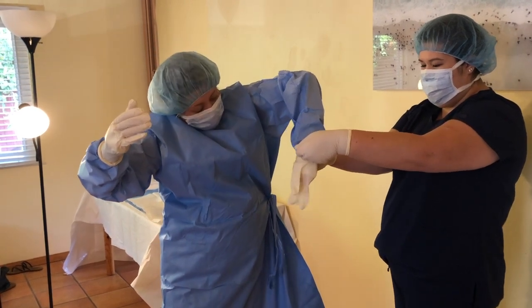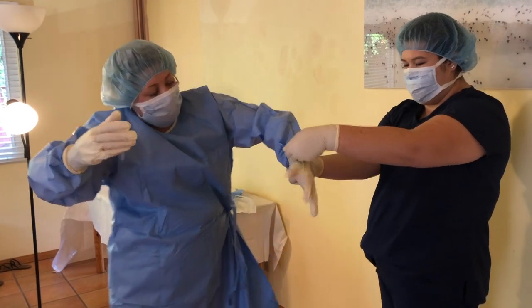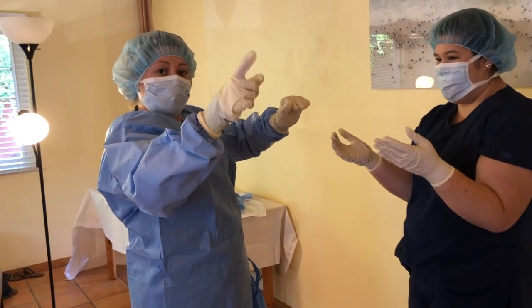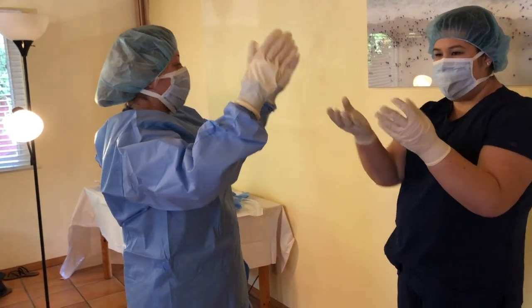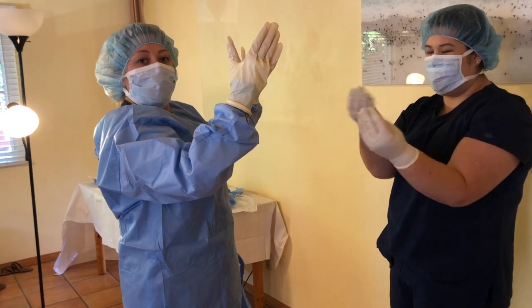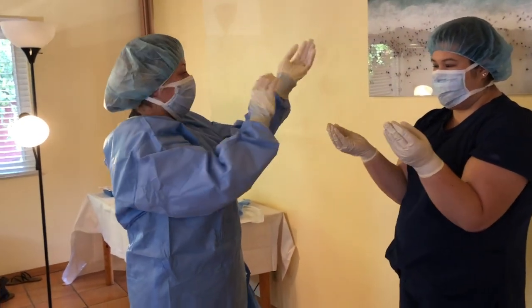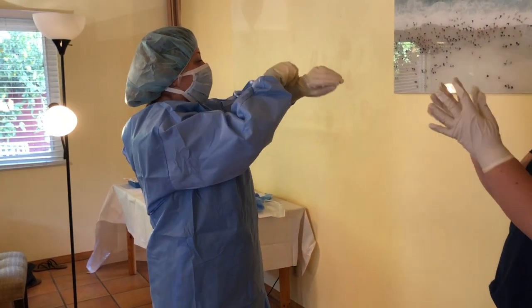So, while I'm doing this, I don't typically want to be spinning around or anything. This glove was backwards, so I did what I could, but in real life, I wouldn't do that. I would hand it to her with her thumb facing the correct direction. So, now I'm sterile. Now I will adjust these all the way down.